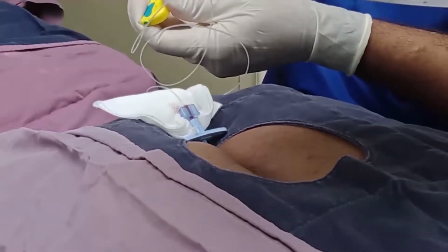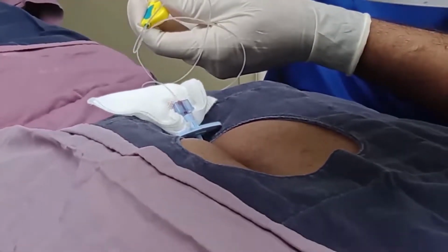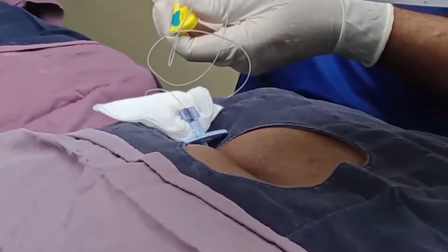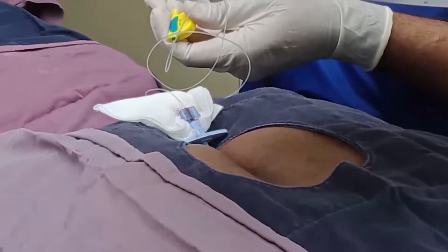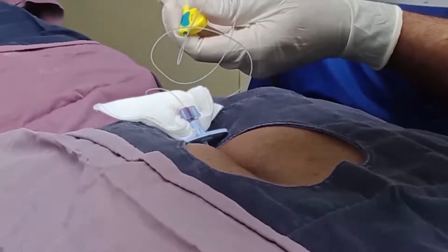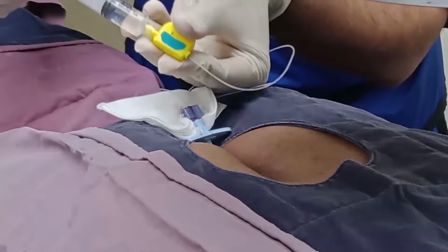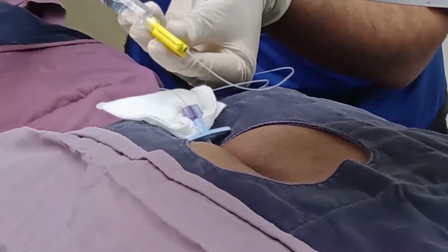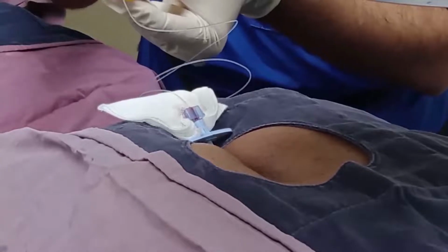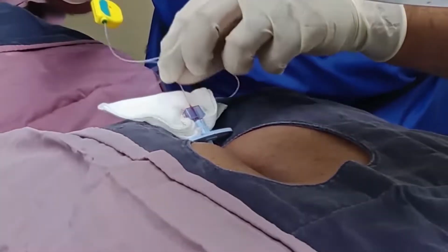At this time, it is important also to warn the patient about any pain related to the pressure, and it could mean that you need to give it more slowly. After having injected the main drug, the catheter is flushed with normal saline and is pulled out.